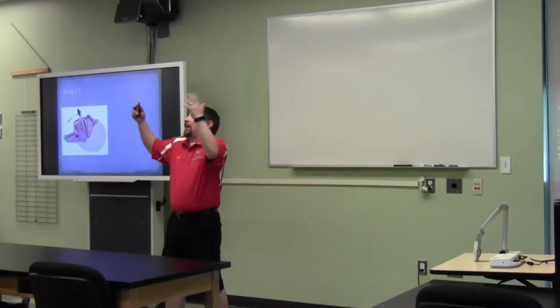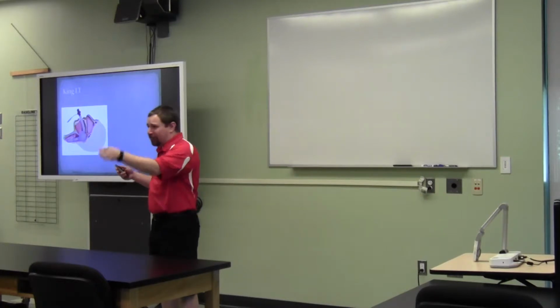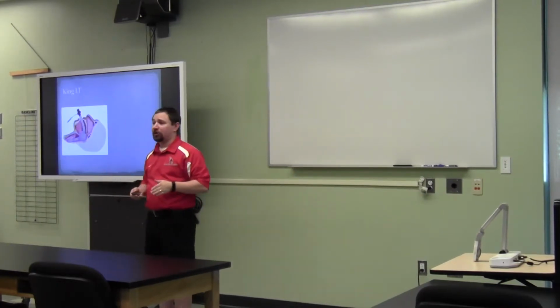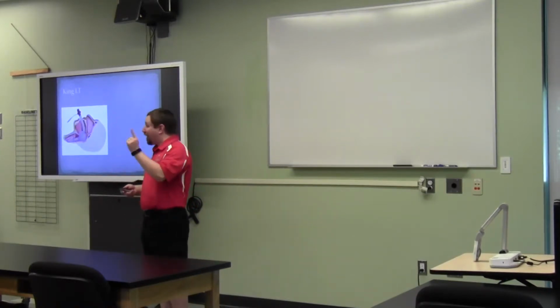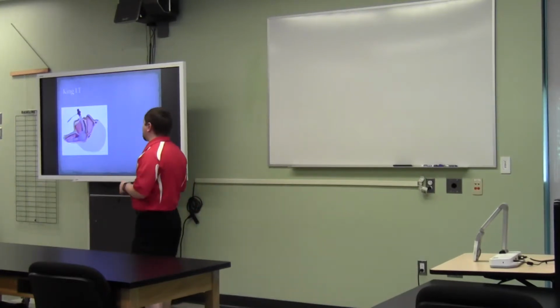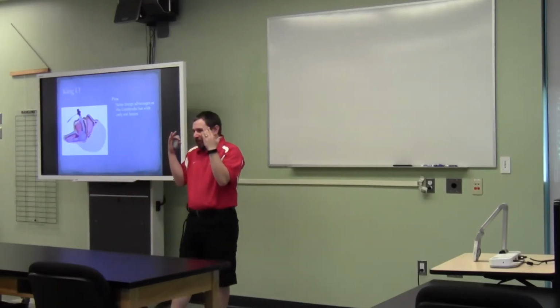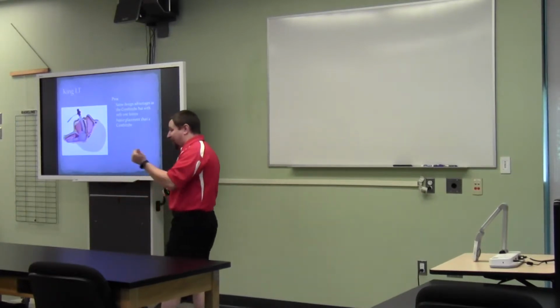So we took all the concepts of how a combi tube worked, but we said, okay, screw it. We're never going to get the tracheal placement. Let's just build the thing to automatically go into the esophagus. And I'm going to make it with 1 tube because I'm never going to get the tracheal one. I don't need the second tube. So we stripped it down to 1. Same device, everything that we loved about the combi tube, but it made it less cumbersome. Faster placement.